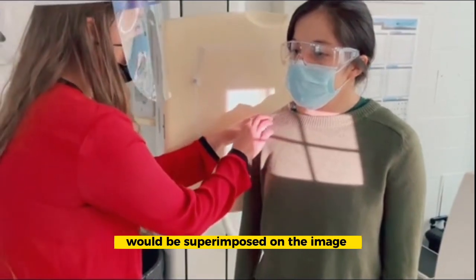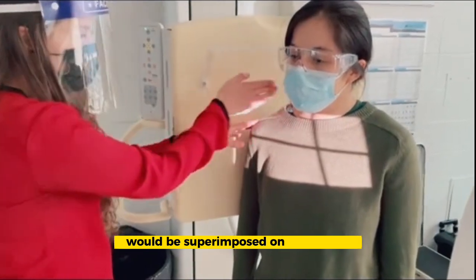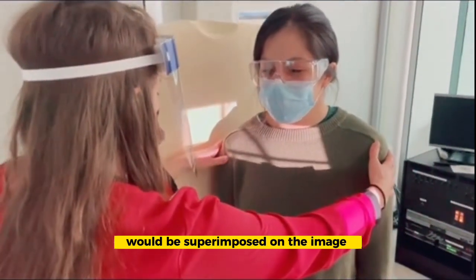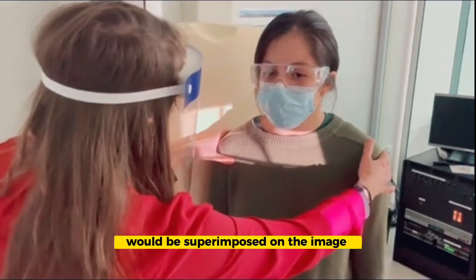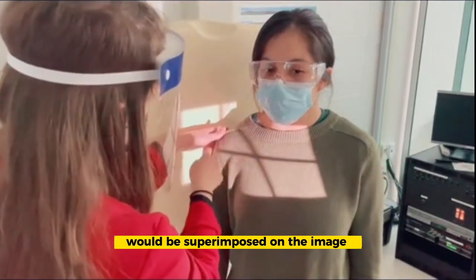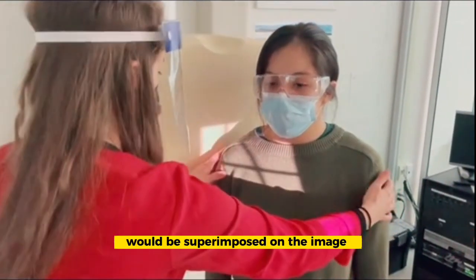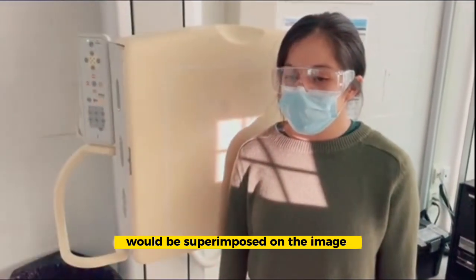For the AP oblique projection of the shoulder, ensure that the line from the acromial tip to the superior angle of the scapula is parallel to the image receptor. This should place the patient between 35 and 45 degrees of rotation. The central ray is perpendicular to the glenoid cavity, located approximately 5 centimeters inferiorly and 5 centimeters medially from the superior lateral border of the shoulder. Ensure tight collimation for clear demonstration of the relevant structures.